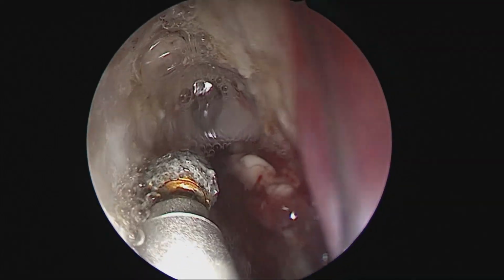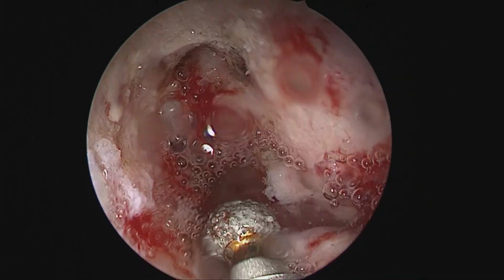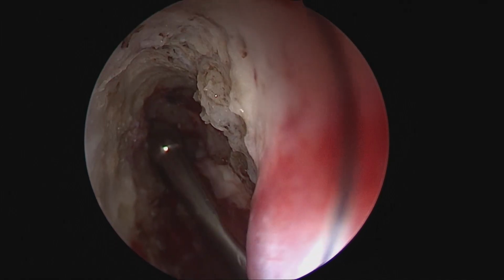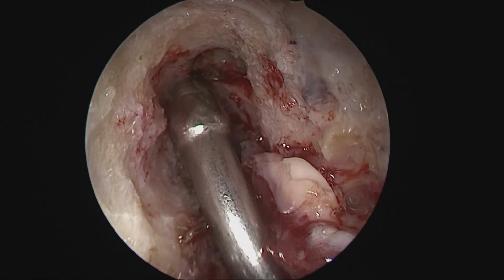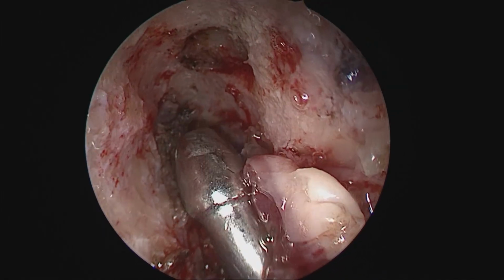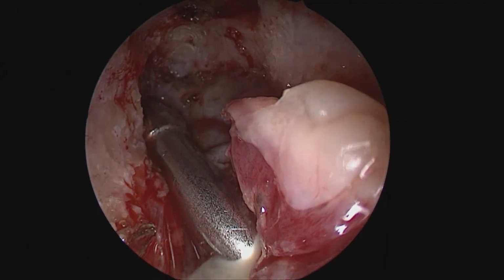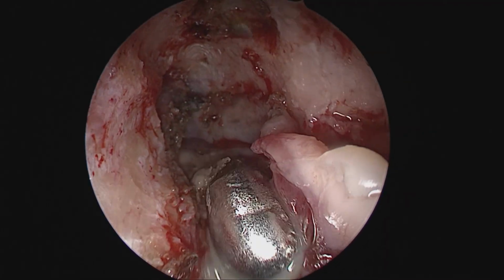We are using here a coarse diamond, which has been used previously as well, and that is why it's taking a little time. But one can use a cutting burr. Normally, we generally avoid a cutting burr here, not so much because of the skull base, but because there is a real risk of puncturing the skin unnecessarily, as there's not much bone between the skin and the frontal nasal process.